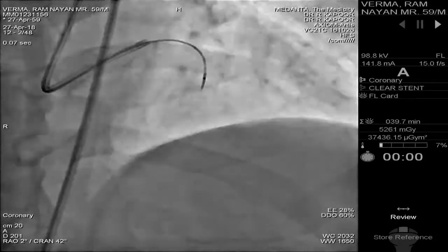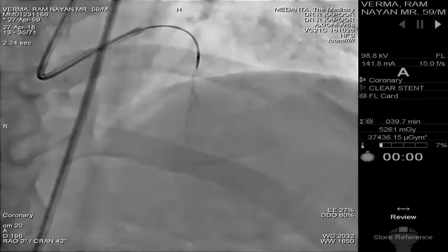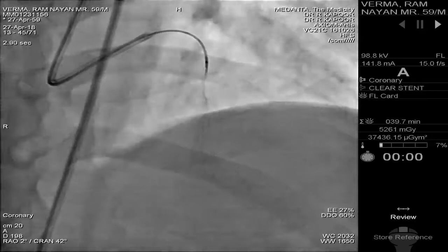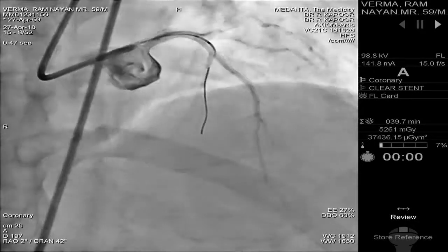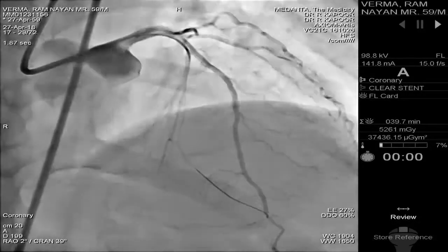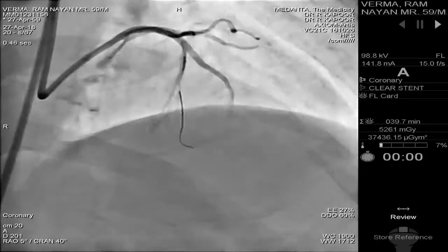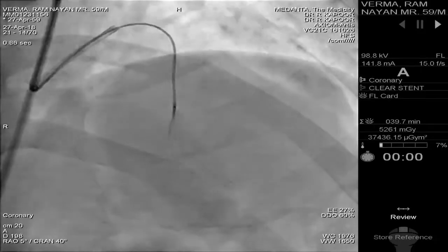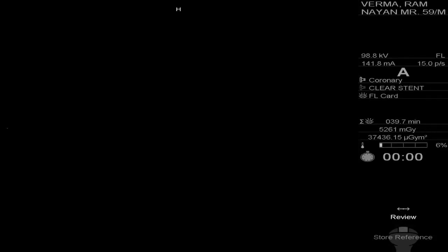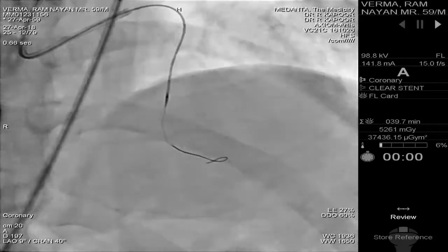Again, this septal branch is not filling the RCA, but this is the collateral which is filling the RCA, so we tried this channel also. Anyway, the crux of the matter is that we were trying this case for 1 hour and thought it would be really thought-provoking if we could go to a retrograde route, cannulate the RCA from the retrograde route, and discuss all the points of CTO opening through it.